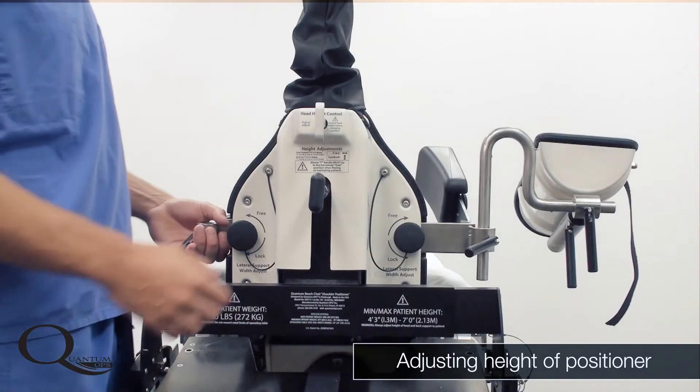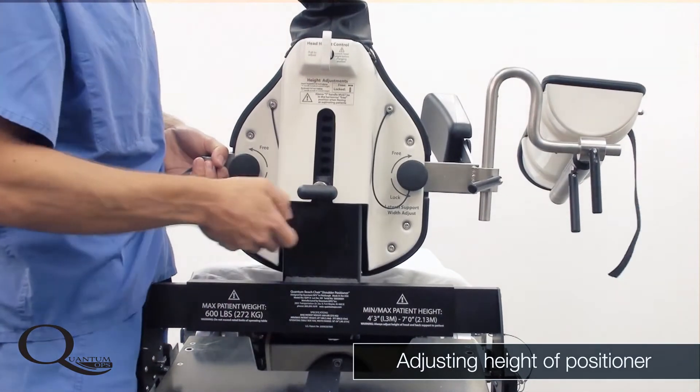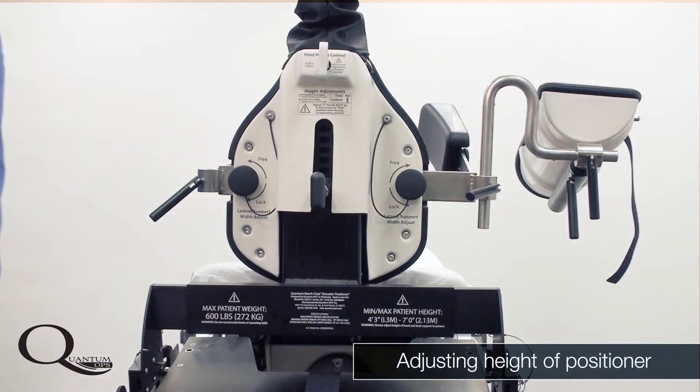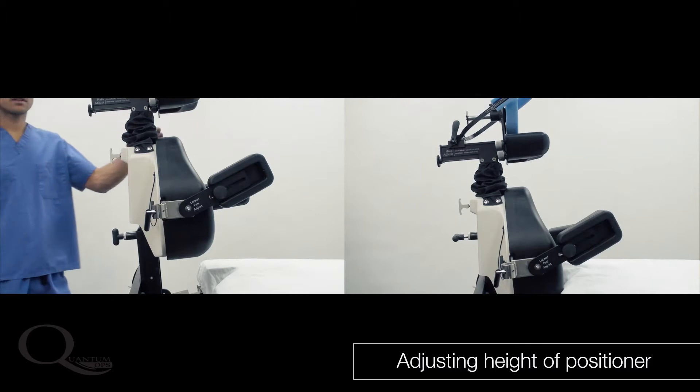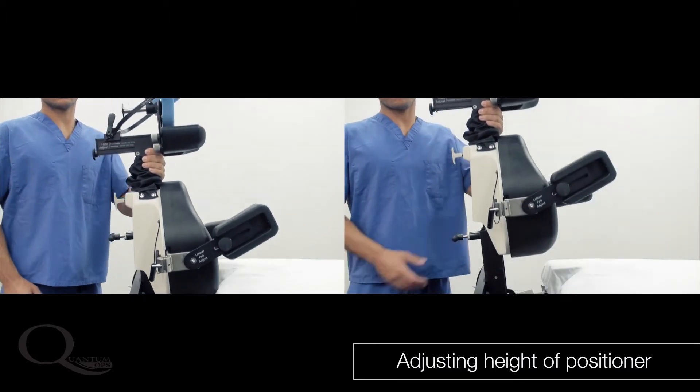The height of the entire Quantum positioner can be adjusted using the T-knob on the back of the unit. This allows the positioner to accommodate the spinal curvature of exceptionally tall patients. The critical thing to remember when adjusting the height is that the lumbar curvature of the backrest pad should be aligned with the natural spinal lumbar curvature of the patient.